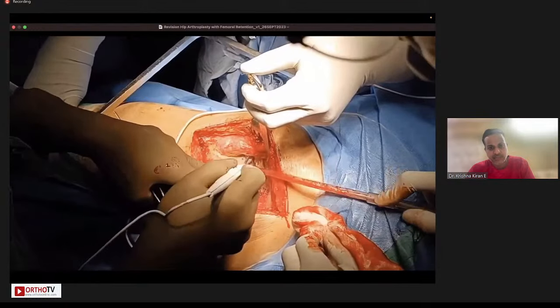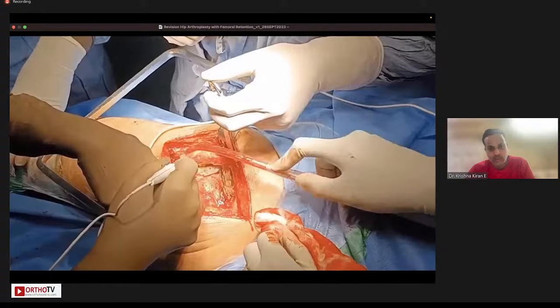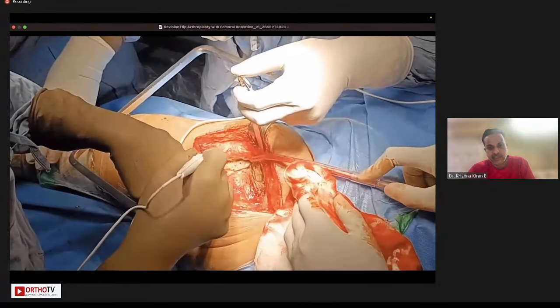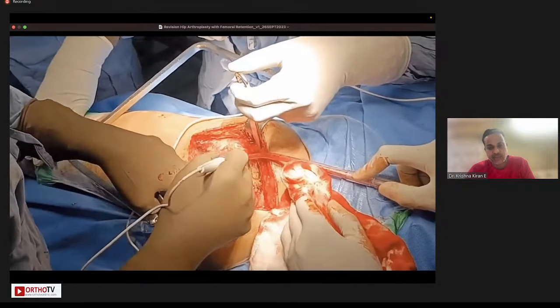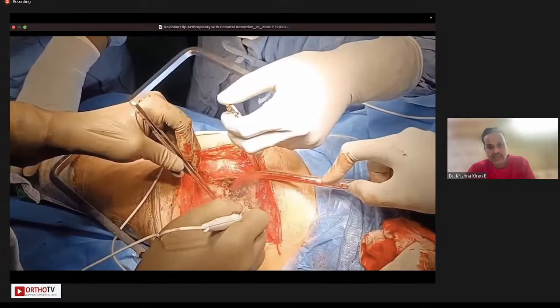And the key step in revision surgery is not to violate the edge of this particular flap. So we have to make sure that all the dissection happens inside the confines of this flap. The edge is not violated. So what we are doing now is we are reflecting this flap out.